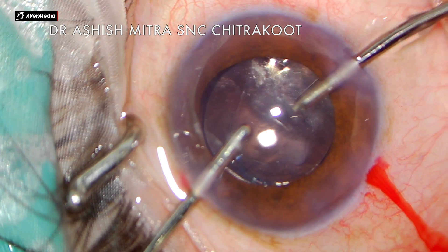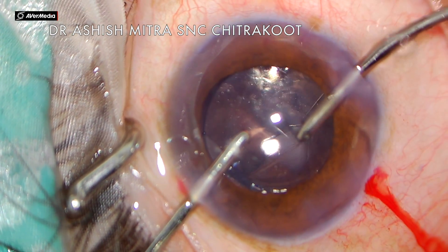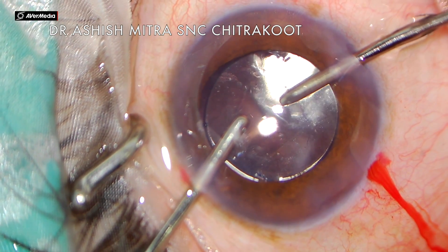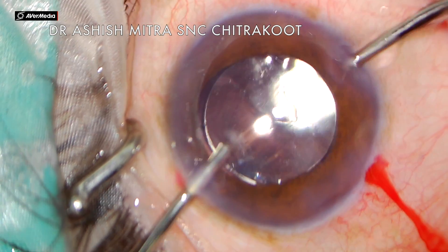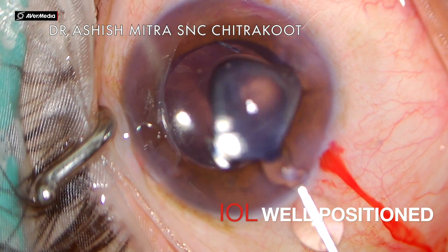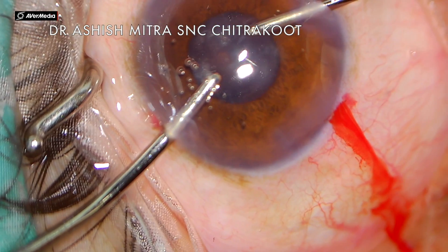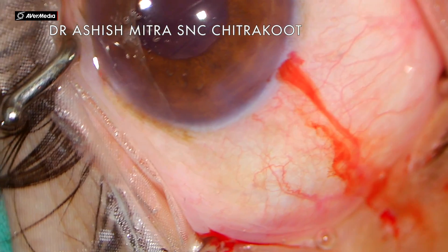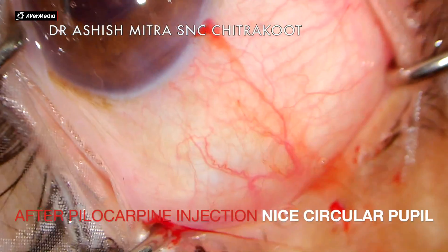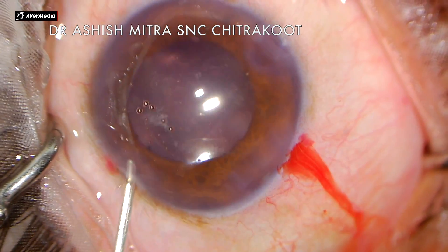After placing the lens, I did irrigation and aspiration since vitrectomy was done and all cortex was aspirated. You can see the IOL is in the sulcus, nicely centered. Just to demonstrate further, one could use pilocarpine, which would constrict the pupil — and that would be a second proof confirming no vitreous was left. After instilling pilocarpine, the pupil has constricted and is circular, confirming no vitreous remains. This case was nicely managed after having a PCR in a posterior polar cataract case.